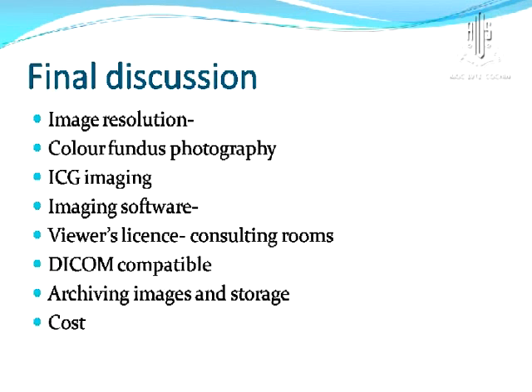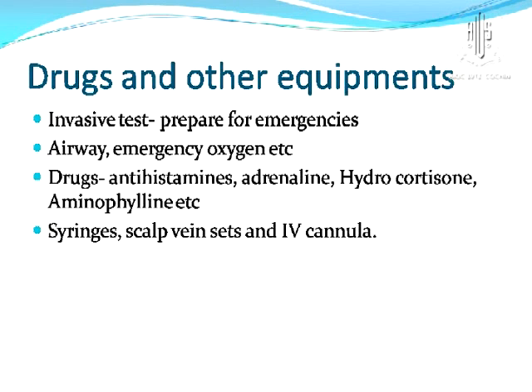Find out whether it is DICOM compatible to store the images and transfer the images, archiving mode and storage, and the cost ultimately. You should remember that fluorescein angiography is an invasive test, so prepare for emergency in the form of airway, emergency oxygen, drugs, scalp veins, syringes, and cannula.